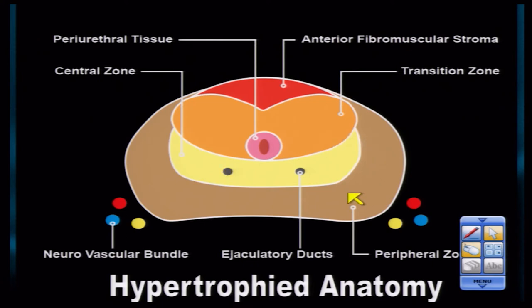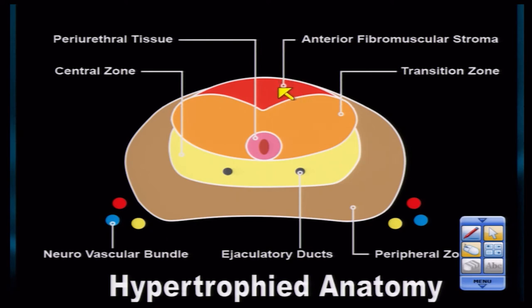In brown is the peripheral region or zone of the prostate. Don't forget there is an anterior fibromuscular stromal area, which becomes very important when you have far anterior cancers infiltrating into this region — difficult not only for the urologist to see, but also confusing for the radiologist, because the stroma is dark and the cancers are going to be smudgy and charcoal-like and also dark. They can blend together — a wax-on-wax-off appearance — and may be very difficult to diagnose without diffusion restriction and other components of prostate MR. It's much easier when you have a simple round hypervascular diffusion-restricted nodule in the peripheral zone. The neurovascular bundles are drawn in at the seven and five o'clock positions in the axial projection.